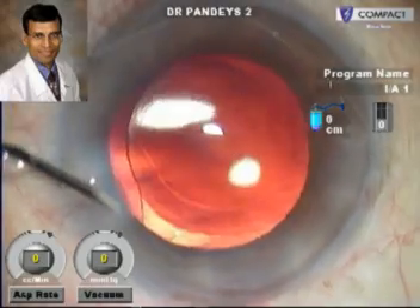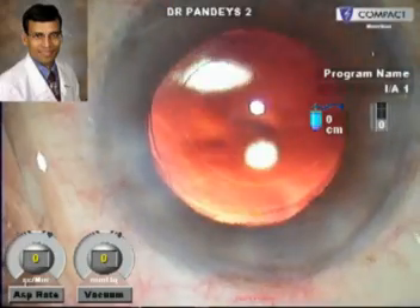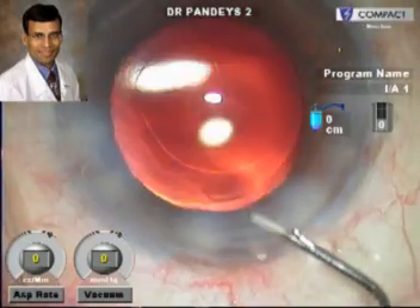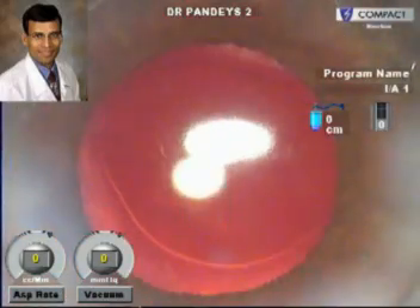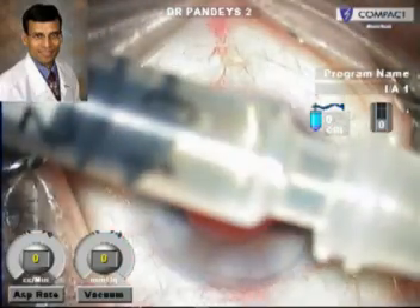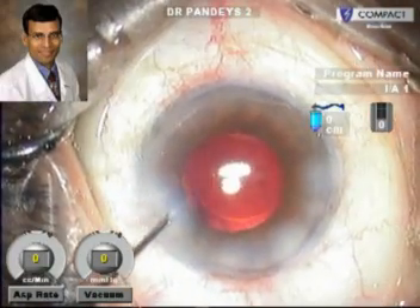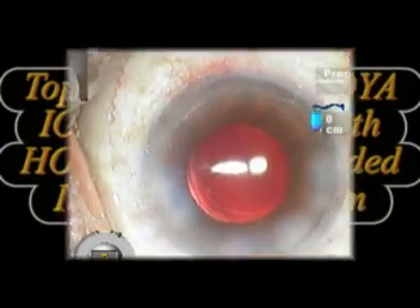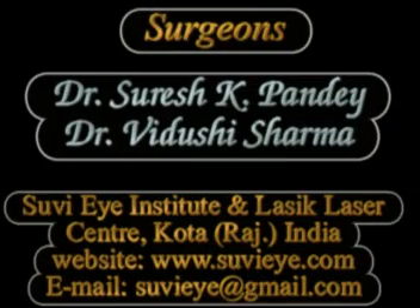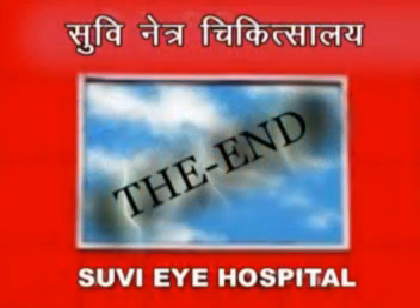As we all know, the use of a preloaded IOL is useful to avoid any damage to the IOL optic or haptic during implantation, which can occur with holder-folder systems and also with injectors where a separate cartridge is used to place and fold the IOL. It also avoids the risk of contamination by avoiding handling of the IOL completely, as the IOL comes packaged in this sterile preloaded injector. Our experience with the first available Hoya preloaded IOLs has been very good since they became available in the Indian market, and we are extremely satisfied with the results. Thank you.